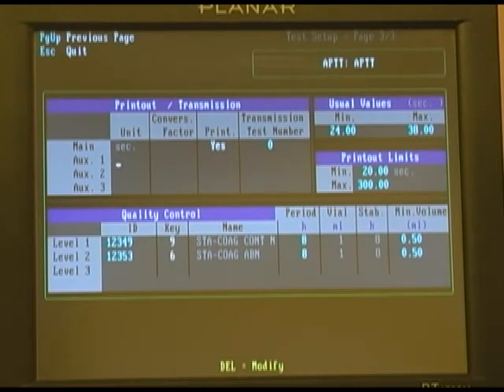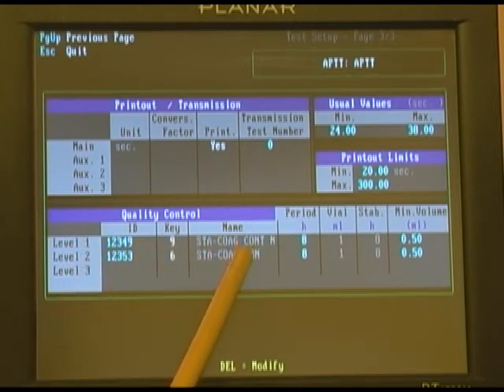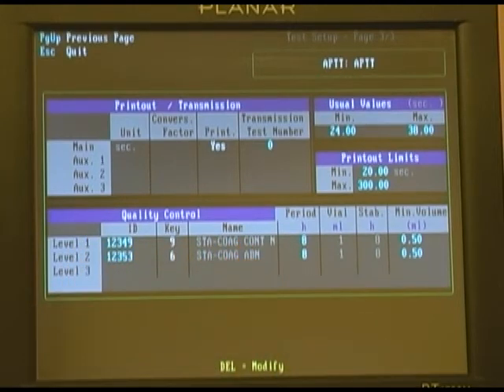To verify this calibration you need to run the control material that is specified on page 3 of the QC screen.